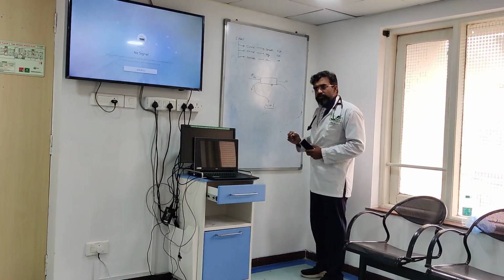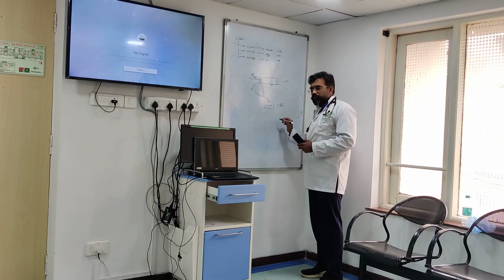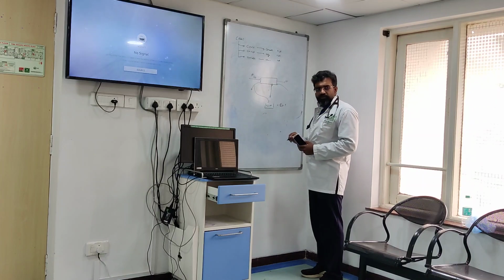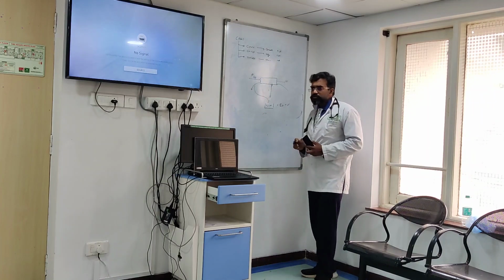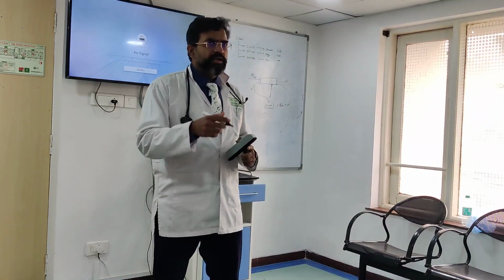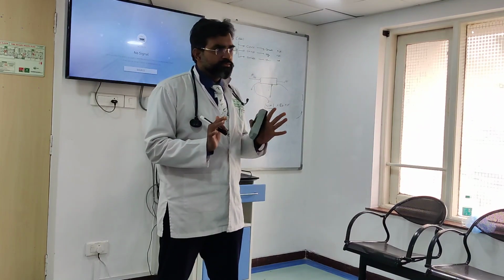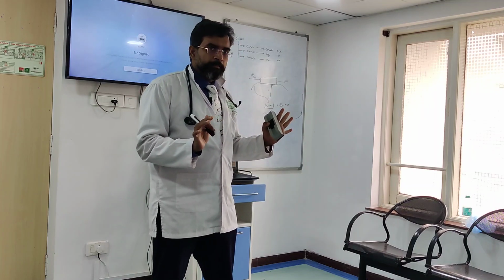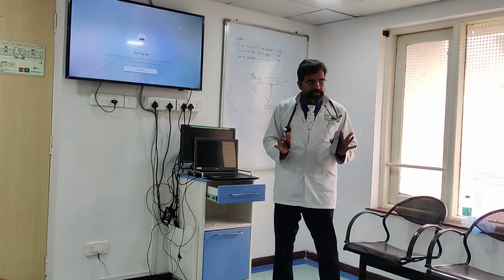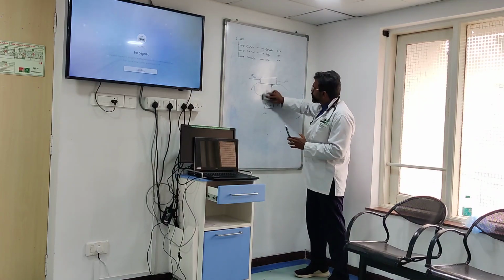Now what is the dose of CRRT CVVHD here? QD plus whatever UF I am adding through here will be my dose. This is my dose of CVVHD. Clear? Again I divide it by the body weight and I have my answer. You understood? Understood this much? We'll go to some case scenarios after some time. Some basic cases will make you understand all this. Clear this? Okay.